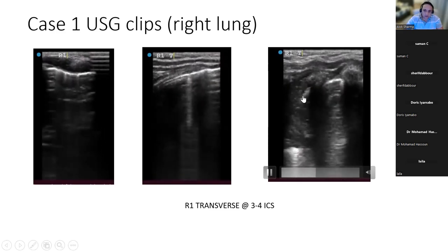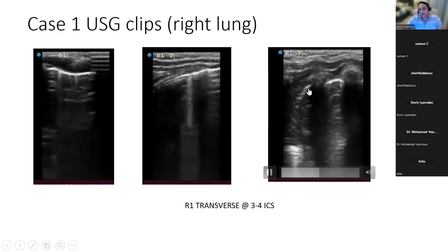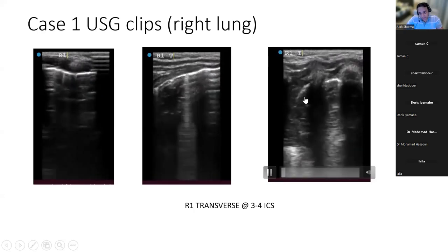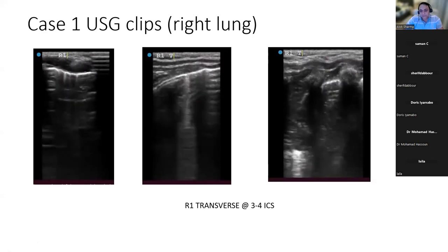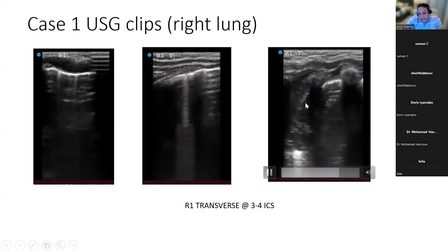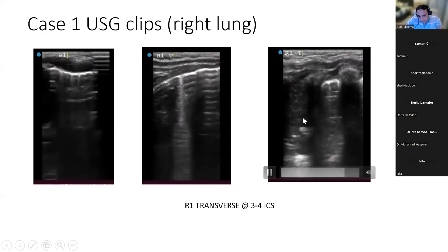Left. Now, you've lost your pleura here. You can't see pleura. Now, for me, that could reflect... Is this not the pleura? This line? It could be. But what I'm saying is you're losing it. I'm not saying it's completely absent. You're losing your pleura there. And that area just below it basically looks like a static bronchogram. Come below. Yes. There.